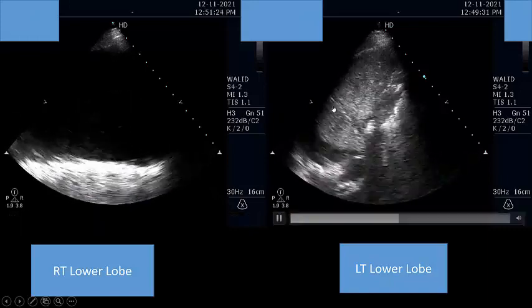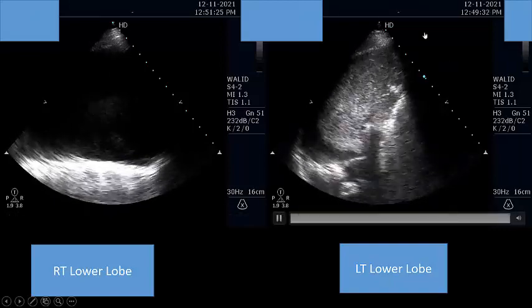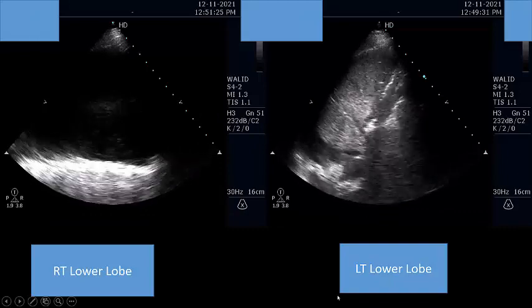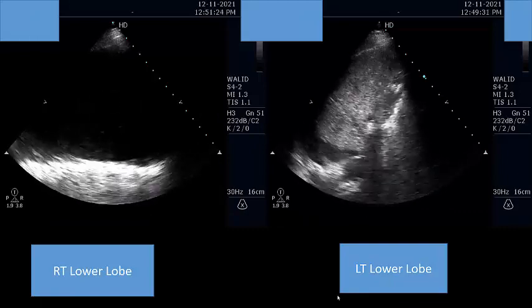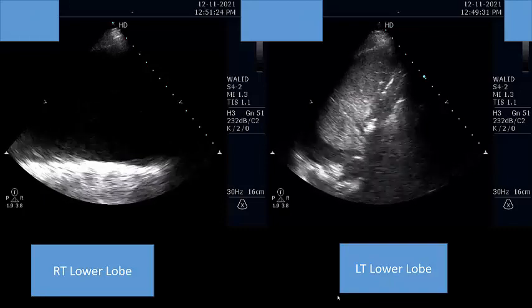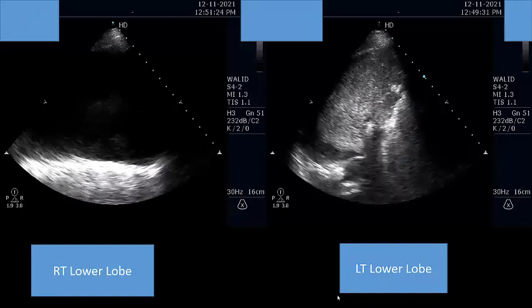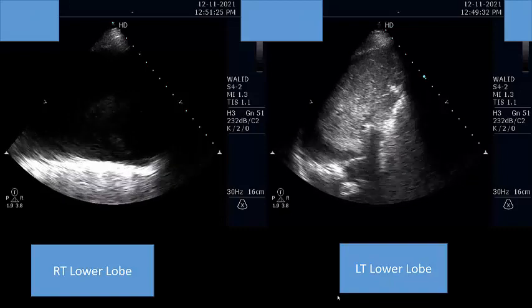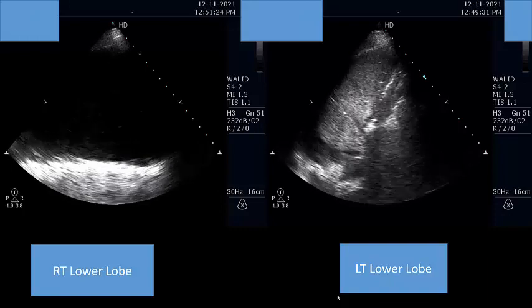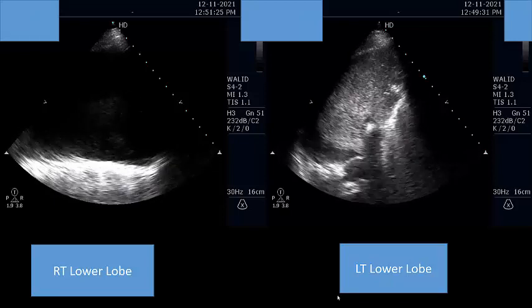So I have two major lobes lost in this patient, one by consolidation and one by pleural effusion. So now I get my point. There is something else causing the patient's suffering besides the heart. I reached this conclusion very logically, by asking myself questions at each stage of assessment, to reach the true fact at the end and the proper diagnosis.